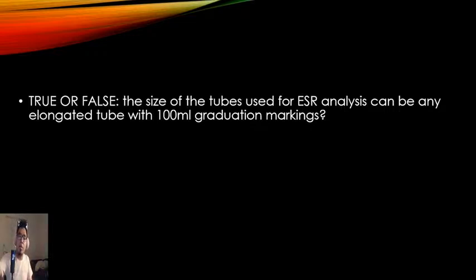Alright. Somebody raised their hand. Unmute yourself. Alright, Christine. Oh, wait lang. Huwag ka naninigaw. Nabingi ako doon. Okay, Christine. Ano po sir, false po yung answer kasi 'di ba yung size po kasi nung tube yung isa sa mga factors na nakaka-affect ng result ng ESR po. So kaya dapat parang standard size lang po yung kailangan gamitin.